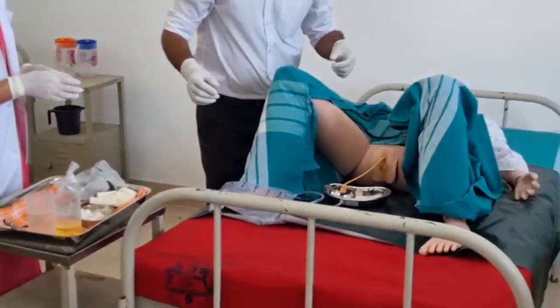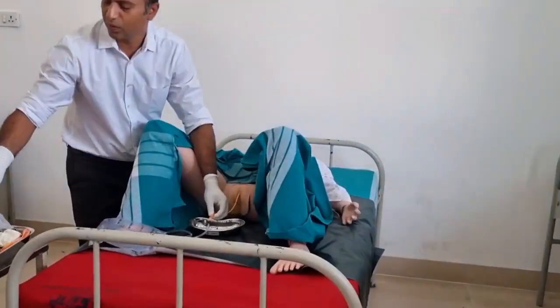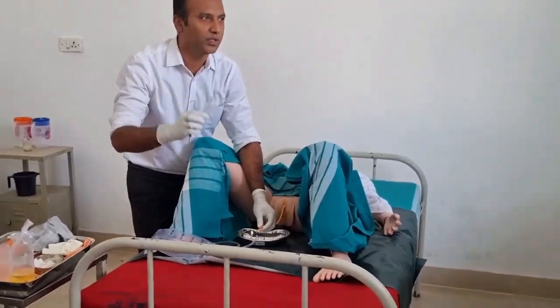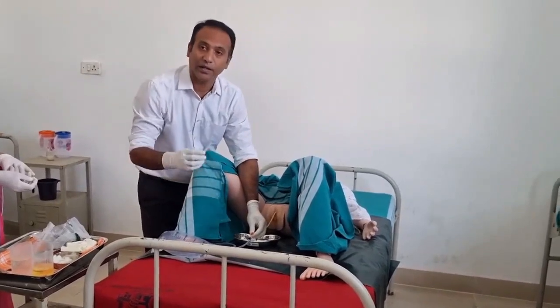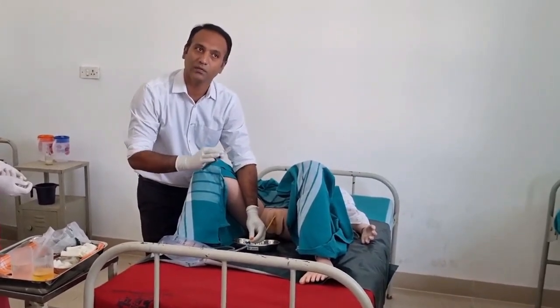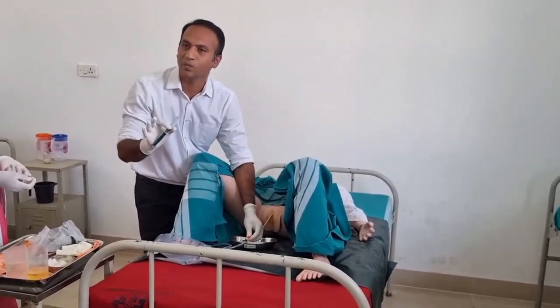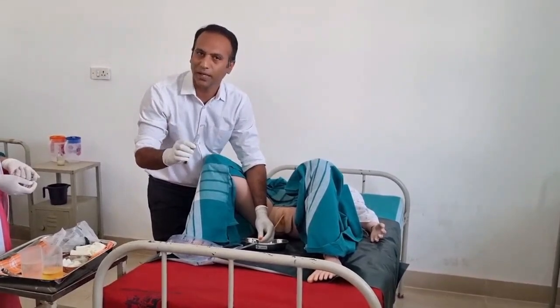So now the inflating part. See, we already loaded 10 ml of sterile water to inflate the balloon of the catheter. And remember, after doing the procedure, you have to document in the case sheet how many ml of sterile water is used to inflate the balloon.